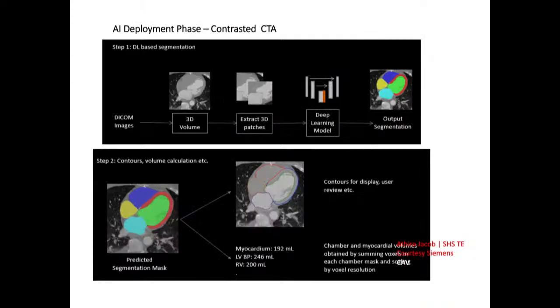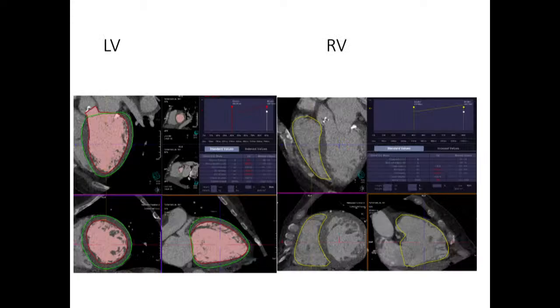And obviously, most of the software we use now has an AI component to it, okay? So given the chamber and myocardial edge, by really complicated mathematical formulas, which I obviously don't understand, it comes up with the output, a segmentation, and it takes into account mostly 3D methods with some AI help.